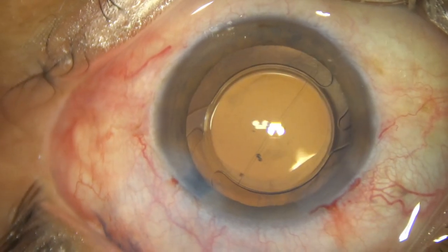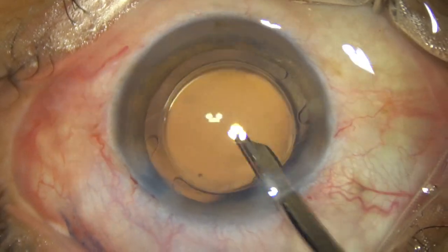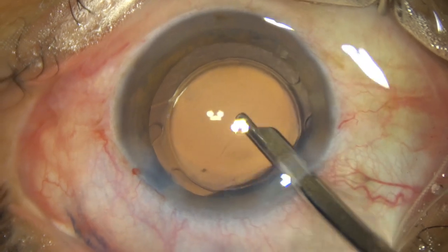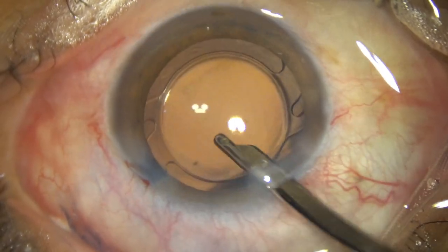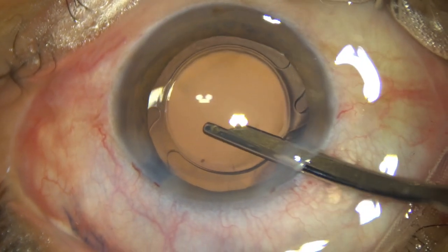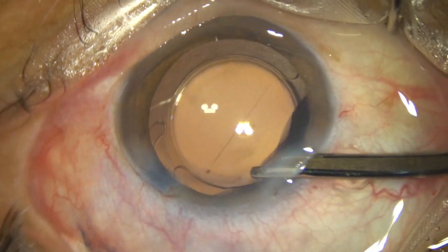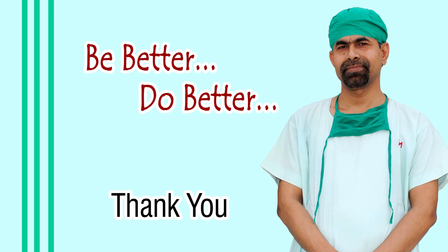And at the end, a final lavage of the anterior chamber is done. Then the anterior chamber is formed very nicely. This is some more polishing of the anterior capsular rim. The anterior chamber is formed very nicely and the surgery is concluded. Thank you very much for your attention. Hope this video will help you in managing your intumescent cataracts. Be a great surgeon and serve your patients with love, respect, empathy and great surgical competence. Thank you very much.